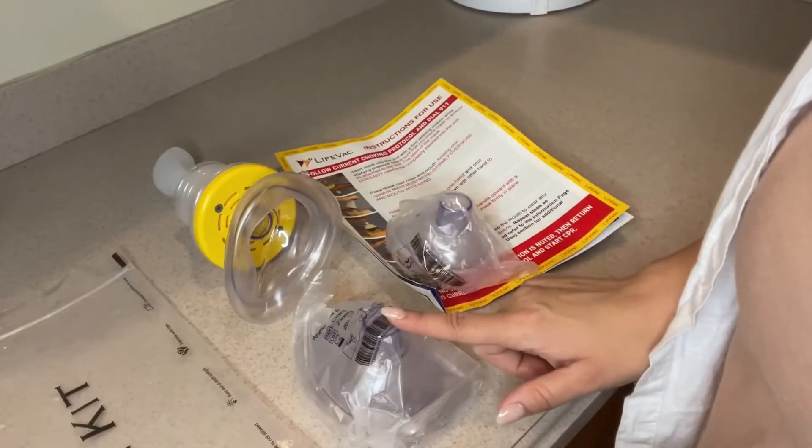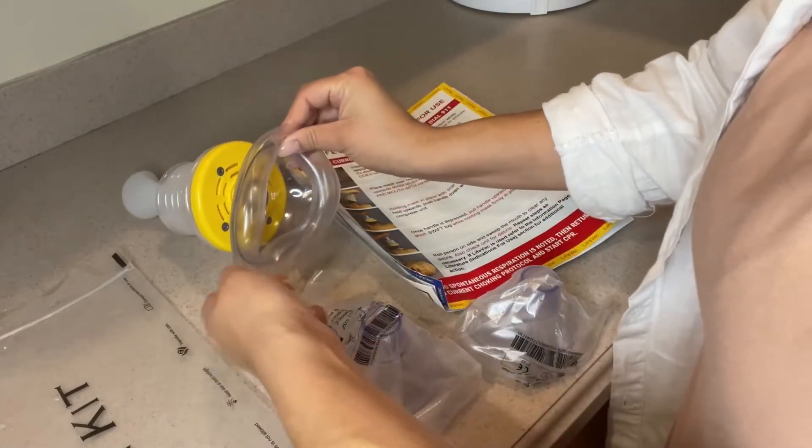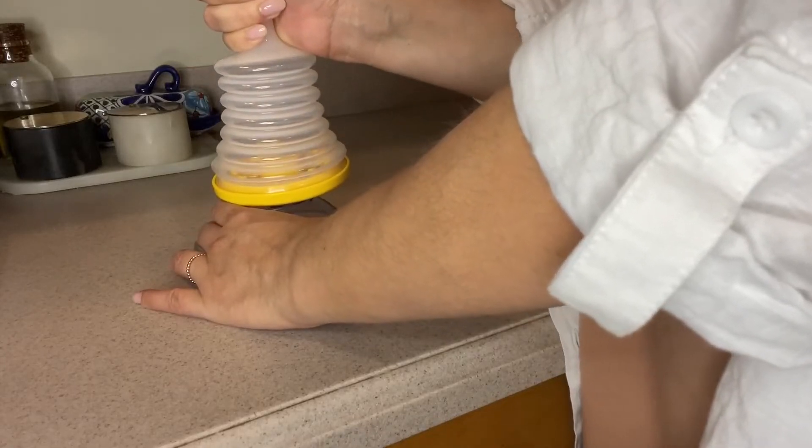This is what is included in the kit — it comes with an adult mask, a kid's mask, and a practice mask. This is awesome because you don't have to waste these. Get used to it beforehand; don't wait until an emergency happens. Learn how to use it.